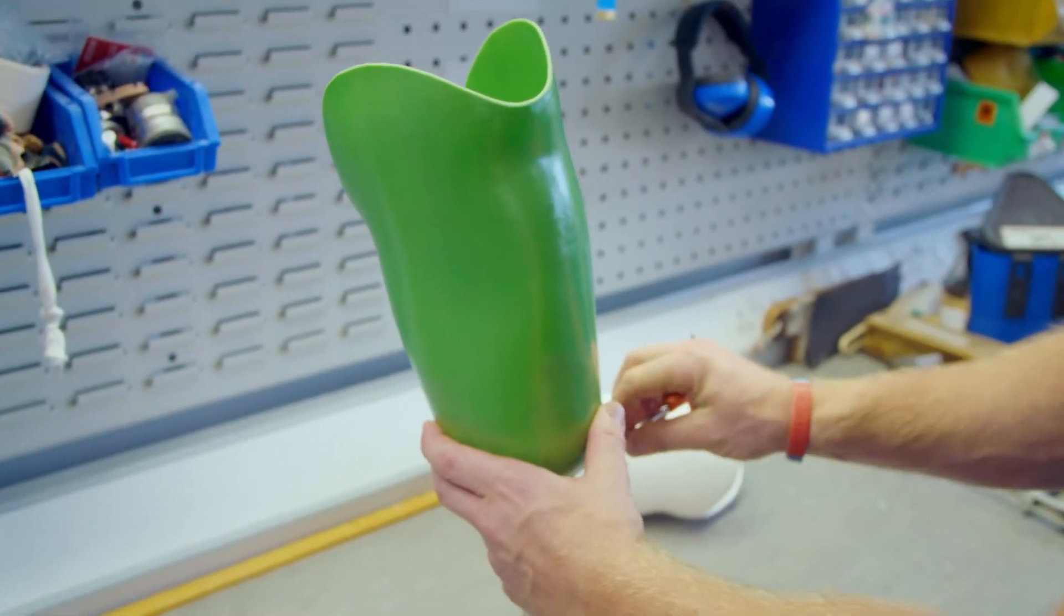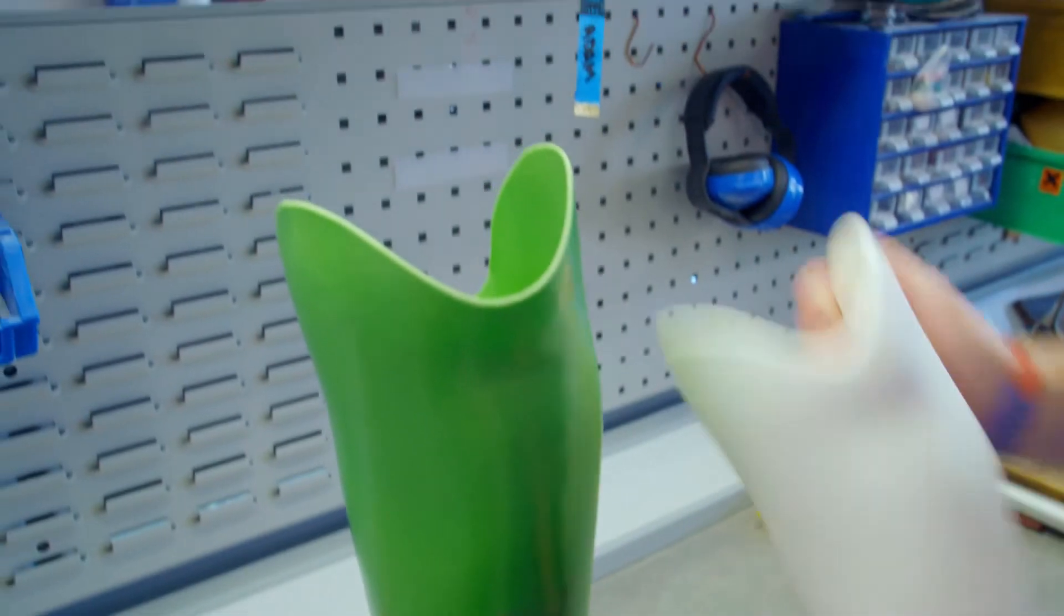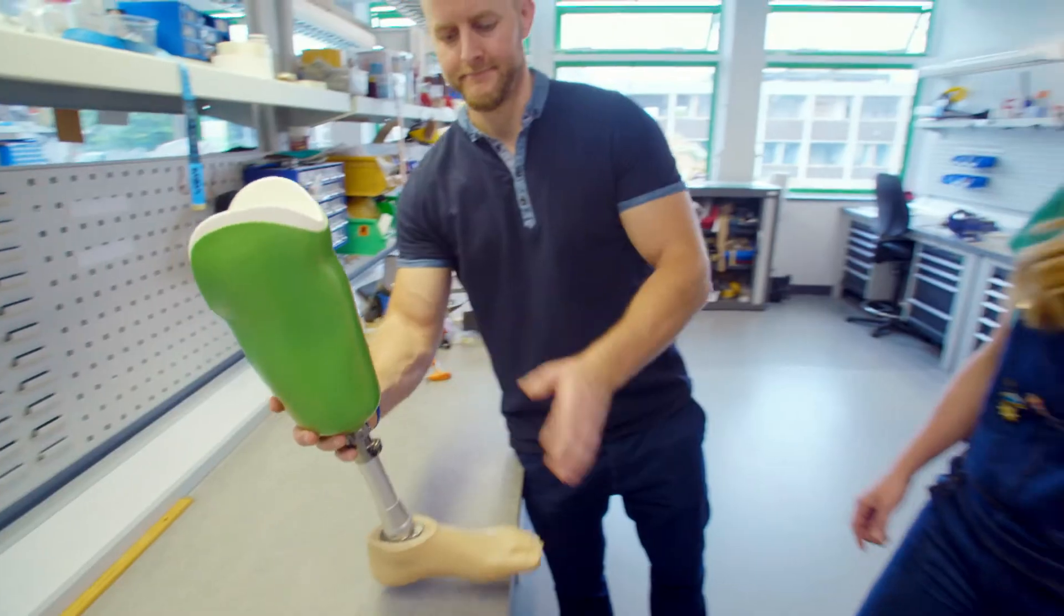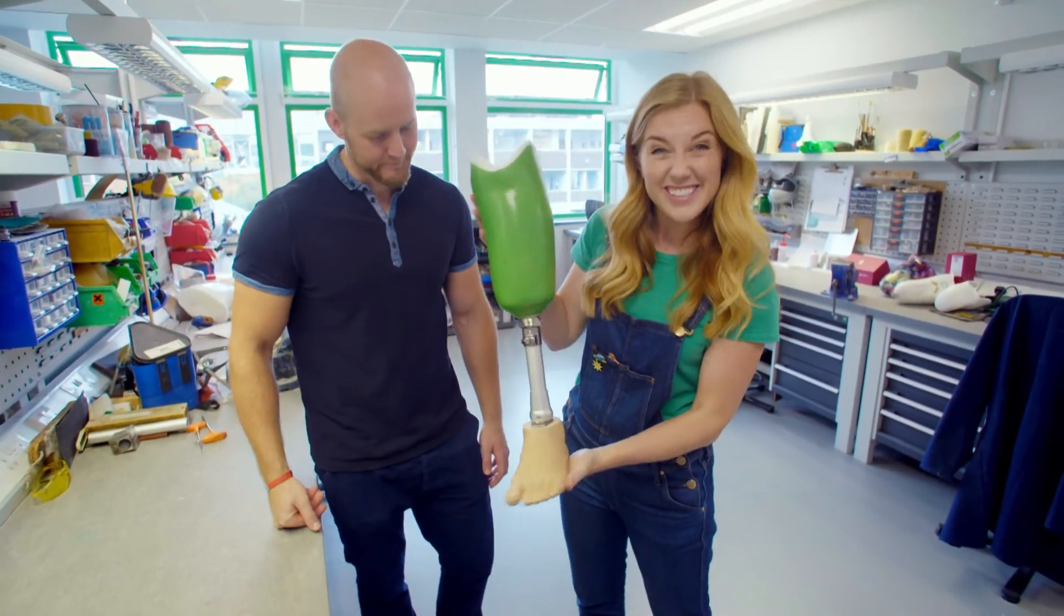The shin tube is then fixed to the finished socket. And look, there's the liner going in too. And here we have a finished prosthetic leg. Doesn't it look great?